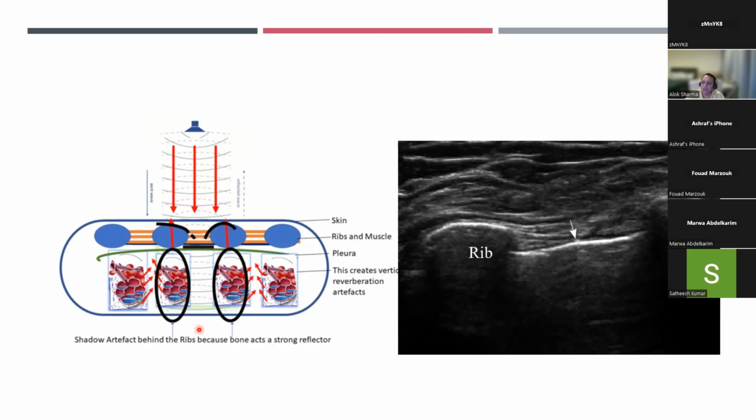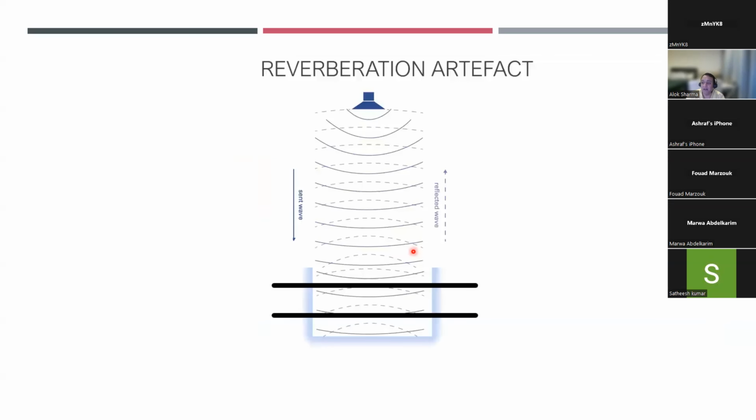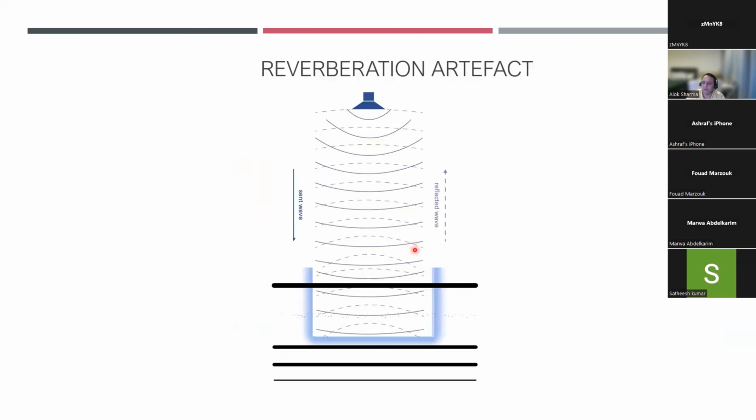Now, I told you there's an interstitium. In this interstitium, depending on the amount of fluid involved, you have fluid arranged in tetrahedron bubbles. These tetrahedron bubbles, thousands and thousands of them, get sound waves trapped in between them, in such a way that they can't come out. Forget this image. We're going to look at the next one.